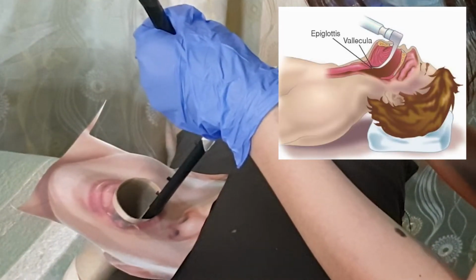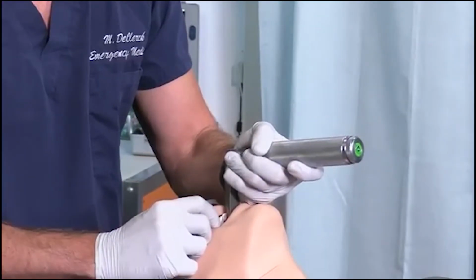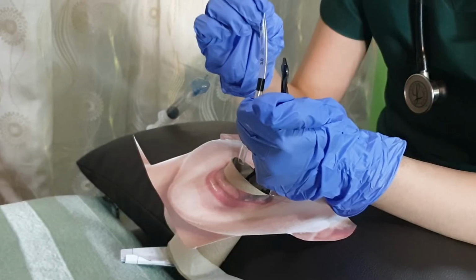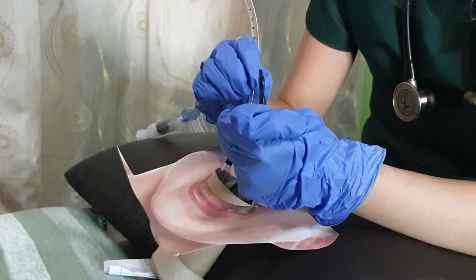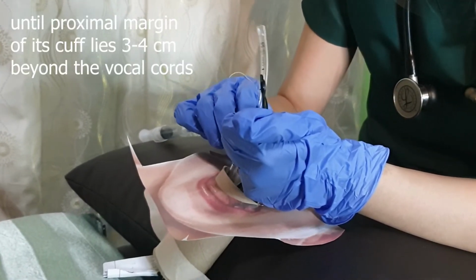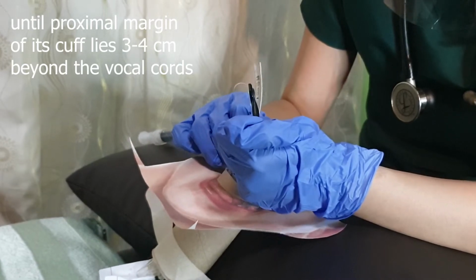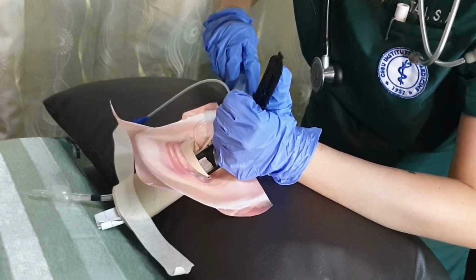The tip of the blade should be placed in the vallecula and lift the laryngoscope upward to lift up the glottis. Then pass the endotracheal tube with the stylet from the right, keeping it from blocking the view of the glottis. Advance the tube until the proximal margin of its cuff lies 3 to 4 cm beyond the vocal cords. Inflate the cuff with 10 cc of air.